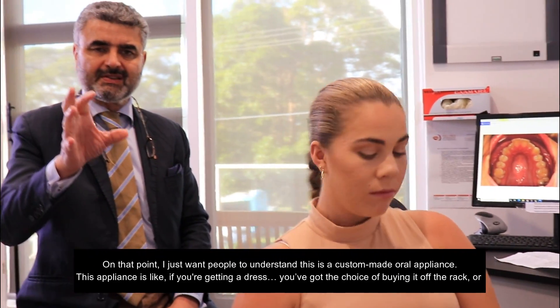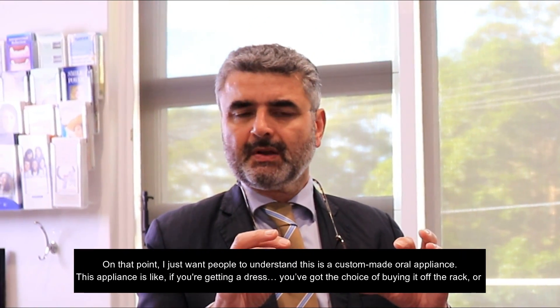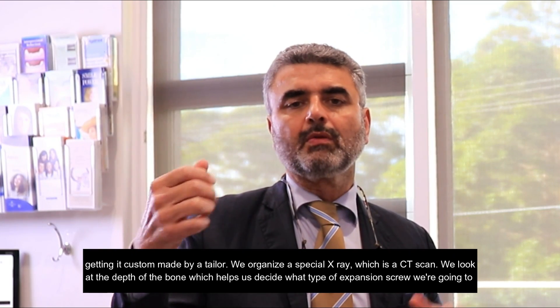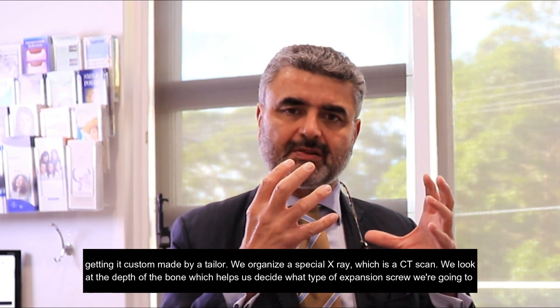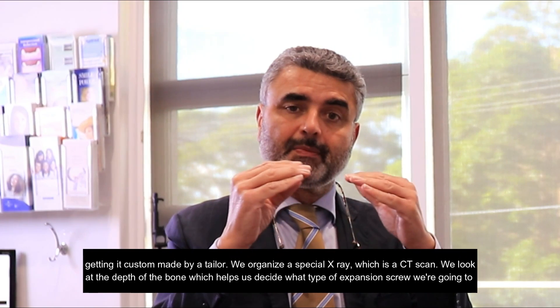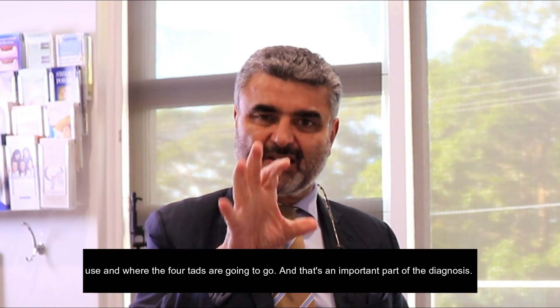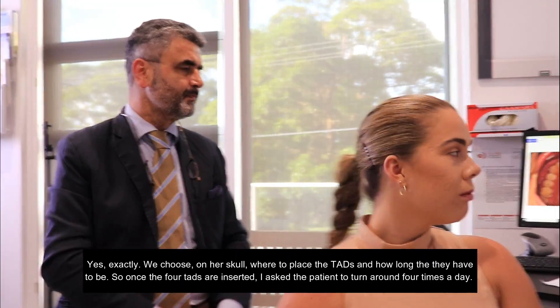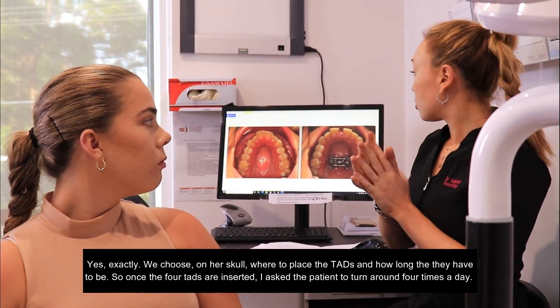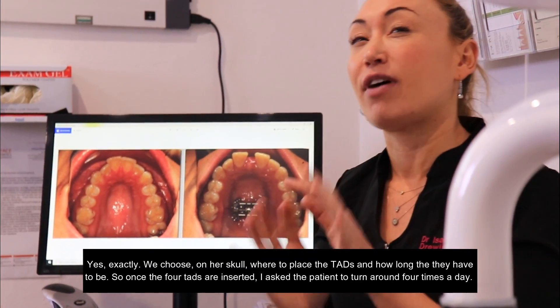I just want people to understand this is a custom-made oral appliance. Getting this appliance is like getting a dress — you've got the choice of buying it off the rack or getting it custom made. We organise a special CT scan X-ray so we can look at the depth of the bone, which helps us decide what type of expansion screw we're going to use, where the four TADs are going to go — and that's an important part of the diagnosis. We choose on her skull where to place the TADs and how long they have to be.